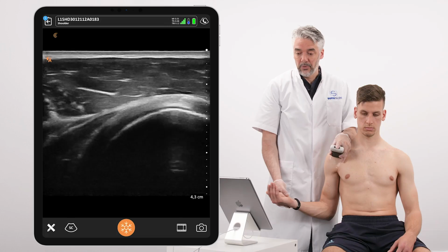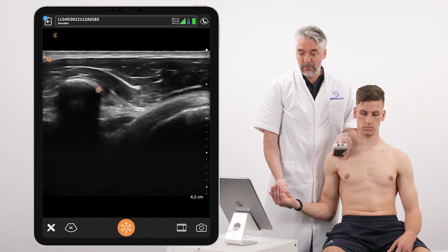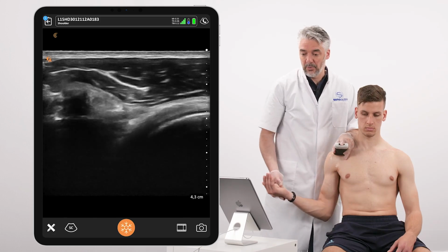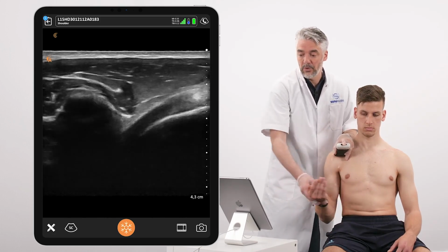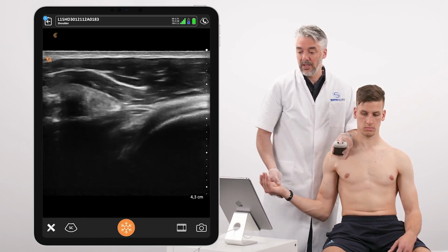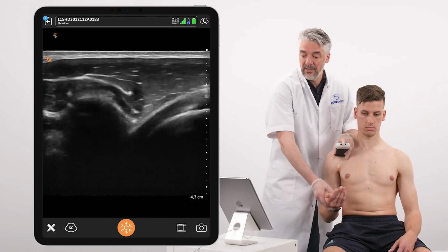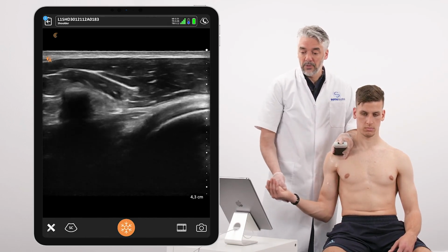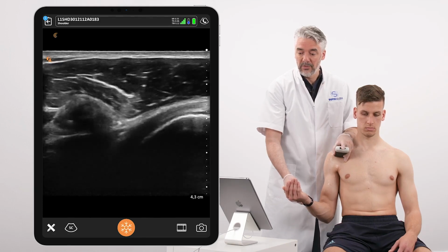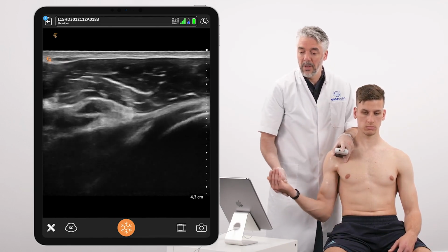and at that level we are going to search for a subcoracoid impingement. So we're going back for internal, external rotation, and now we're going to look for fluid collections that might pop up from underneath the coracoid process, and we're going to search for impingement of subscapularis and bursa at the level of the coracoid. So I'm not only going to look at this level from the bone, but also a little bit lower, where we can see now the interaction between subscapularis and coracobrachialis muscle right here.